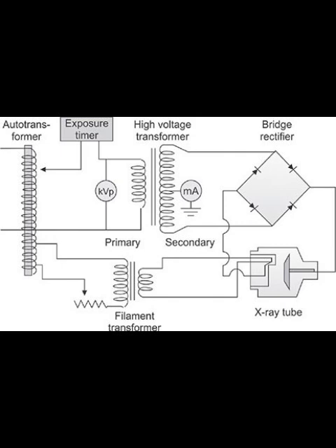Okay, crystal clear. So let's trace the journey now. We've talked about all these components, rectifiers, transformers, controls. Let's put them together and follow the path of electricity through a typical X-ray system's main circuits. It's like an electrical roadmap inside the machine. Sounds good. There are essentially three main circuits we need to consider. First up is the primary circuit. Primary. Okay, where does that start and end?